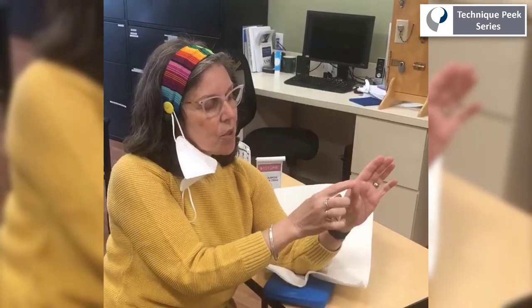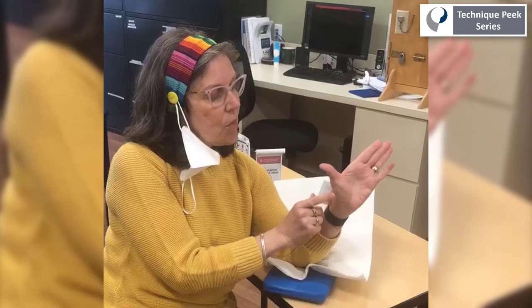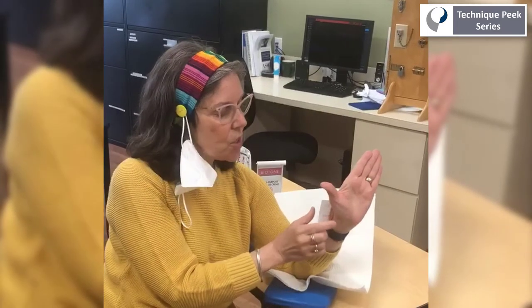Now I'm going to tell the person to take their thumb — see the arthritis here where it's a little loose joint — and I'm going to have them go into radial abduction. When they go into radial abduction, see how that bump goes away? Even if it's a fixed joint and it doesn't go away, that's the position.